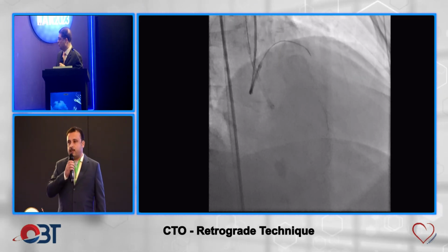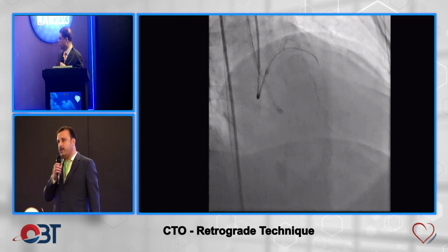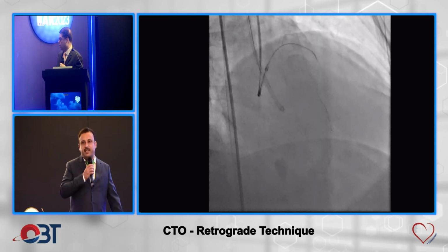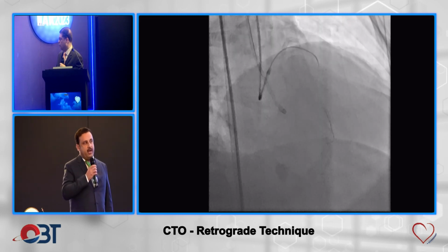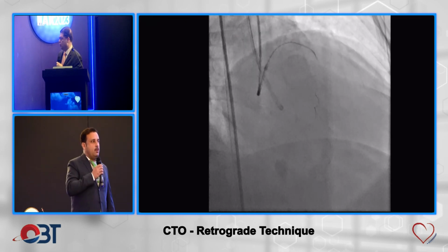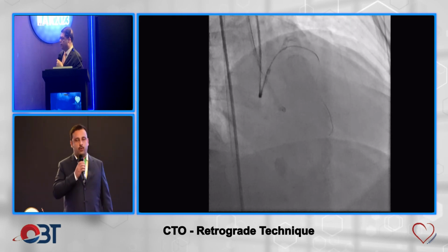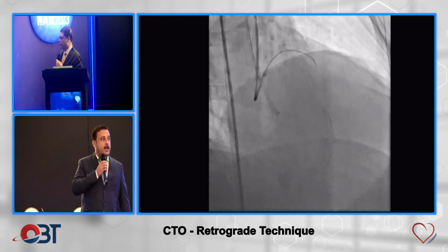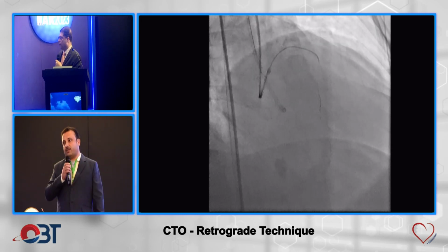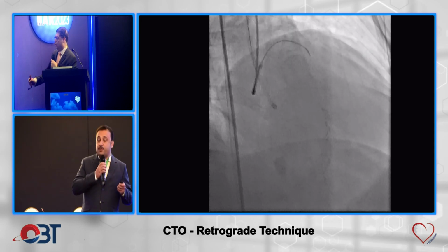In this technique, what we do is that we take a soft or a steerable wire, which is non-polymer jacketed or could be a polymer jacketed or a hydrophilic wire, which is least traumatic. So the choices are different. One of the wires is the SUOH 03, which is the lightest wire with a tip load of 0.3 gram, and it is hydrophilic, non-polymer jacketed. And also the Sion, which is also hydrophilic and non-polymer jacketed. The polymer jacketed options we have.